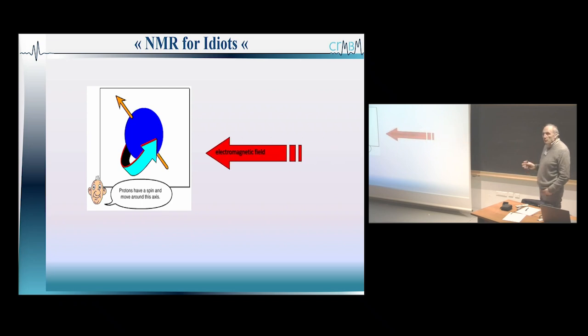And then if you send a magnetic field onto these nuclei, you are going to do one thing which is very specific. You are going to make them spin in a unique, predictable way. The way is actually a frequency. You are going to impose a frequency of oscillation on the nuclei of interest due to this strong magnetic field.